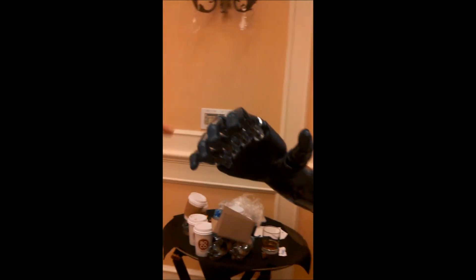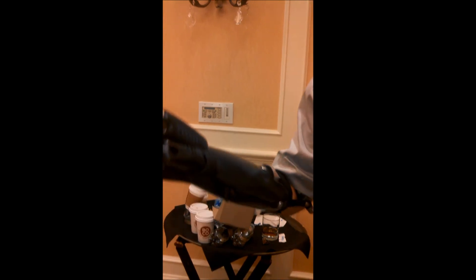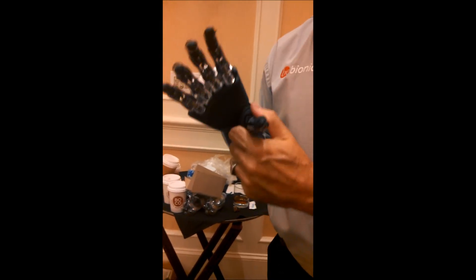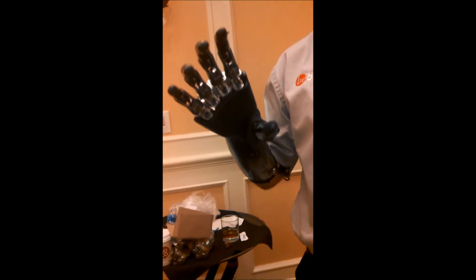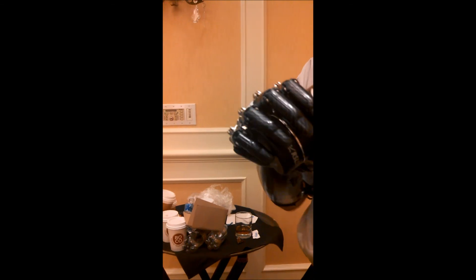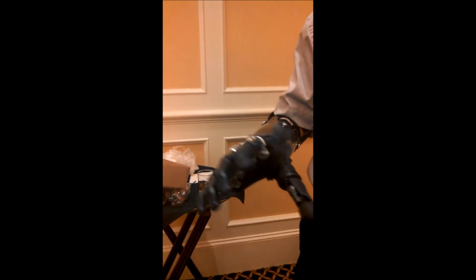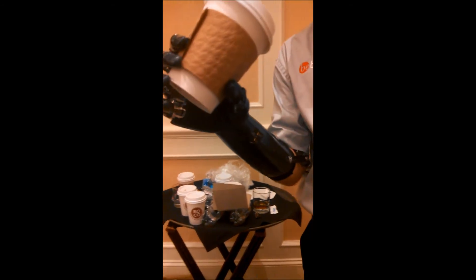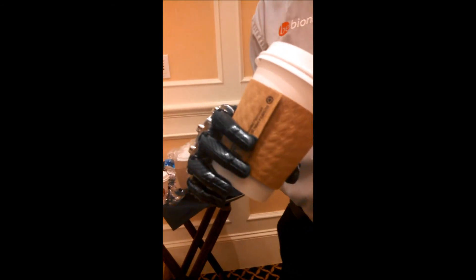Can you control each individual finger? That's the column grip that lets me get the hand through a coat sleeve or push something heavy without the fingers folding back. What happens with the hand is that the fingers will stop when they meet resistance. You can see how the pinky curls around the bottom there. When holding anything or shaking a hand, it'll just stop. It can hold something as light as a coffee cup, or if something's heavier, it'll close down harder on it.